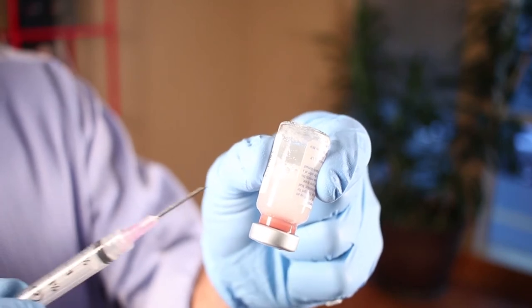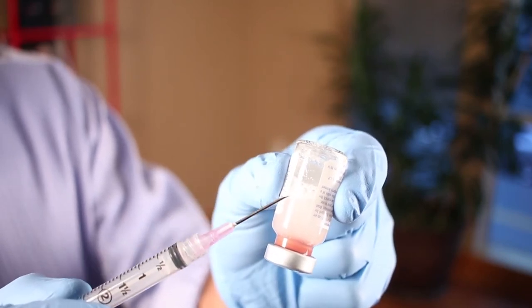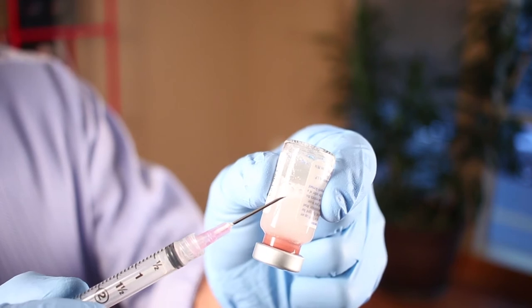Now, the vial of Sculptra contains mannitol, of course the PLLA, and carboxymethylcellulose — and that last one is what clogs the needle.